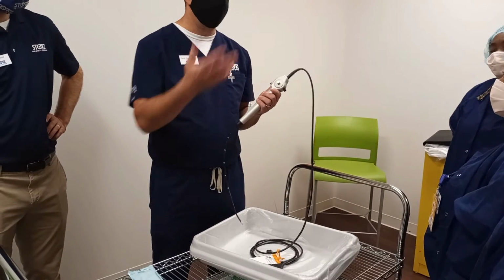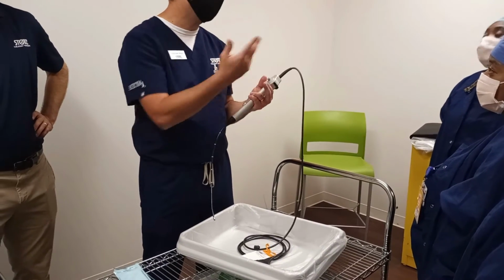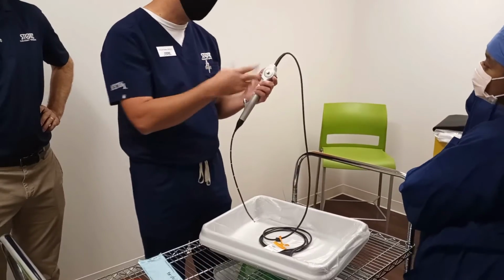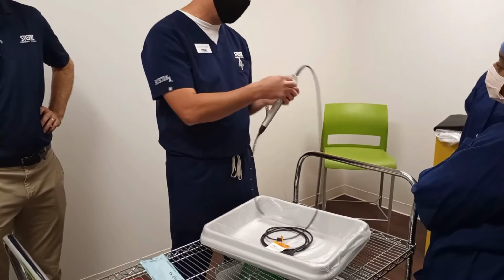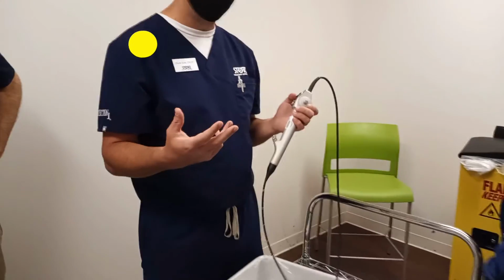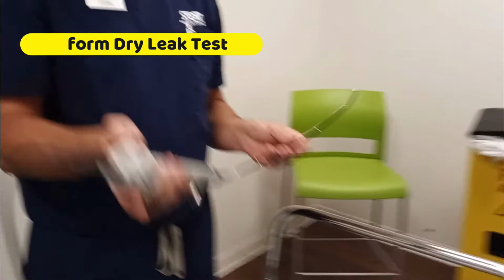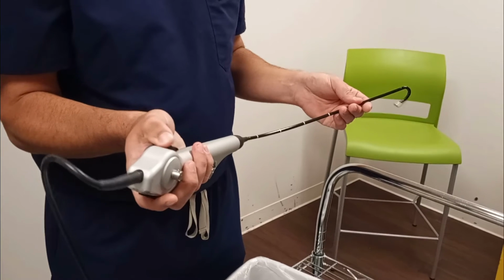So you guys say you have the manual or the reverse scan. So for our sake, for example, let's just say we're using the Karl Storz. We attach it to this block right here. We want to pressurize it up to 200 for a dry leak test. And when you pressurize it up to 200, you're going to use this lever right here. It's going to deflect the distal tip of the scope.